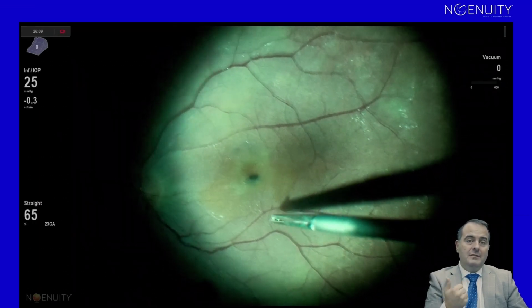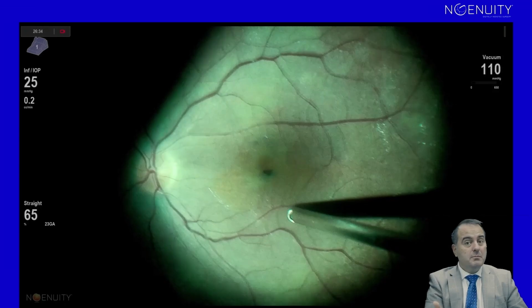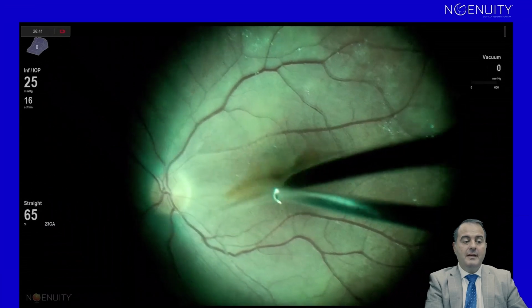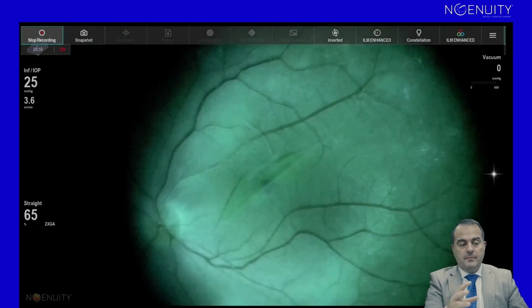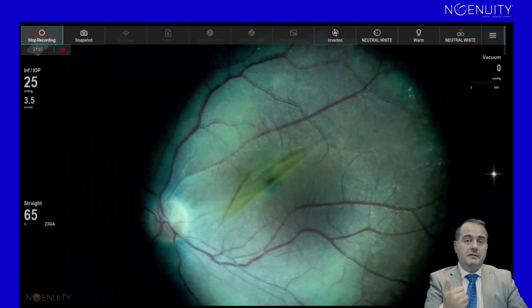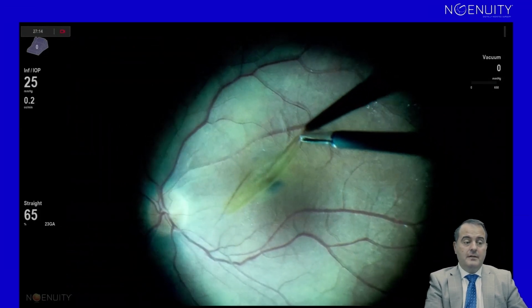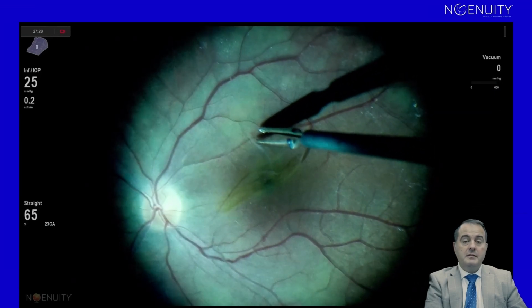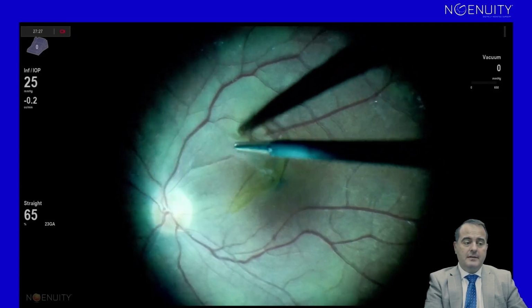And now, again, without dye, just with digital filter, we can see the epiretinal membrane or the hyaloid split which is there, and we can see it perfectly well in order to safely remove it from the eye. Now, there will be different filters scrolling because one of them might be better than the others, as in this example. So you will see how without any dye, again, no triamcinolone, no blue, no ICG, and the membrane is perfectly visible. You can also appreciate the depth of field which the system has, and the focus that we have.